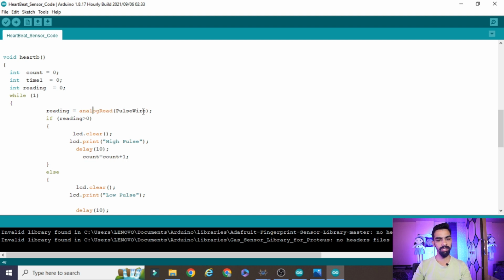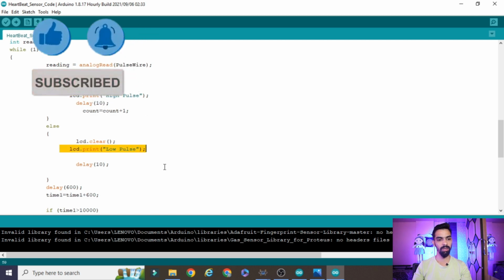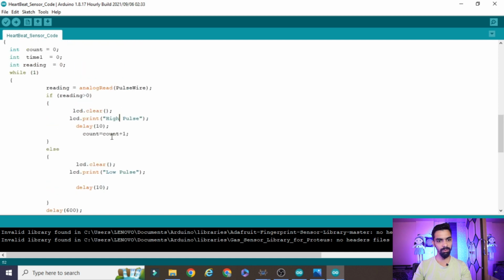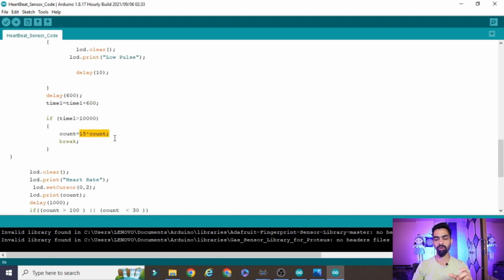Now here you can see first we are reading the pulses from the pulse sensor. If the pulse is greater than 0, then a high pulse is detected, so we increase the count by 1, that is the logic, and we print on the LCD that a high pulse is detected. If the reading is 0, that means a low pulse is detected, and we print low pulse on the LCD. Then there is some delay, and the timer is increased by 600 milliseconds. You can see the timer goes 600, 600, 600, continuously. If the timer is greater than 10,000, that is 10 seconds, then whatever count was received, that high pulse count, is multiplied by 15. That is the logic to multiply the count.